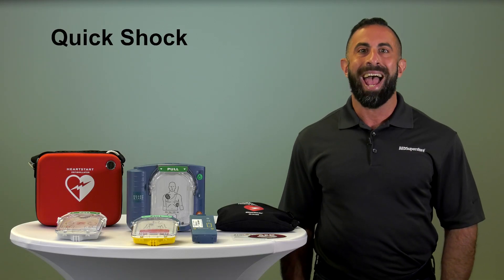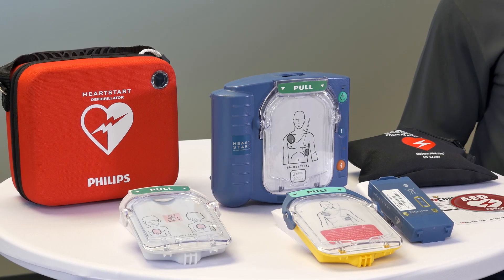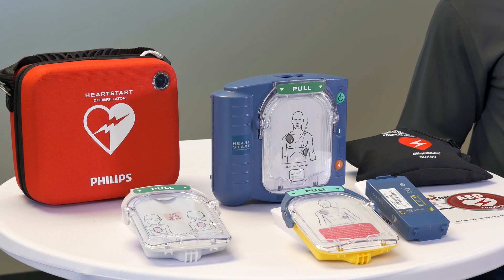The QuickShock capabilities help prevent wasted time during a rescue. It runs daily self-tests to ensure the unit is ready to be used in time of emergency.